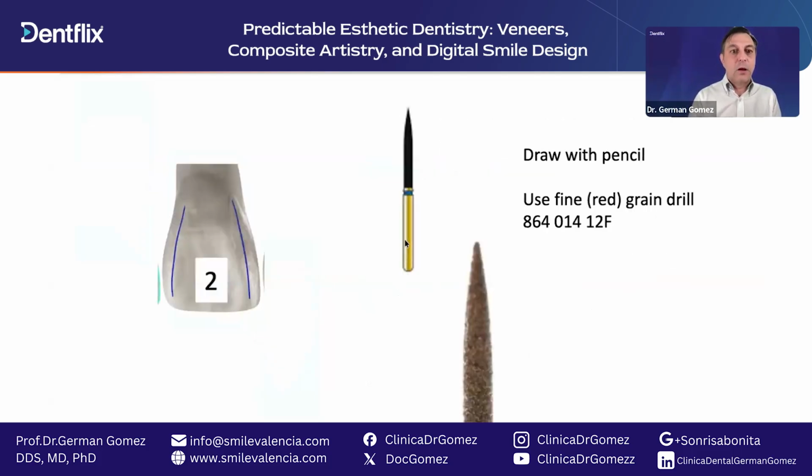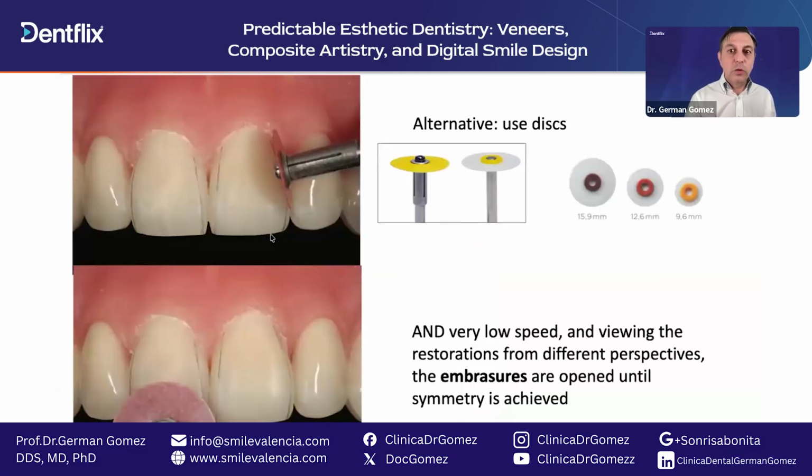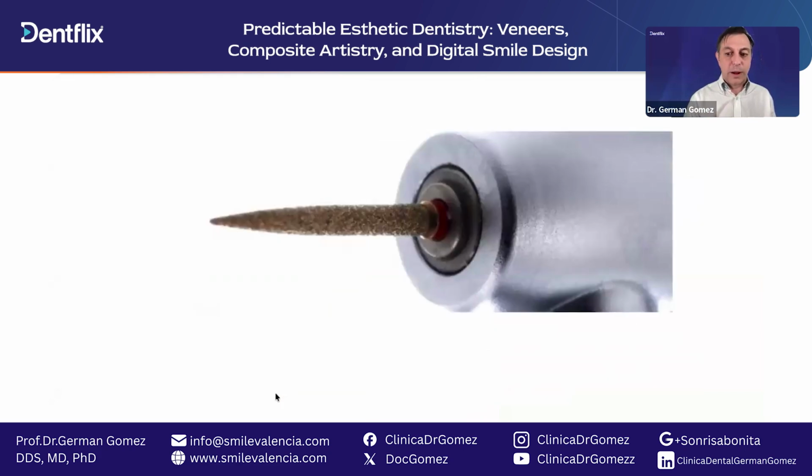How do we do that? We do these lines by drawing with a pencil. You draw with a pencil on the composite, and then you take away distal and mesial of these lines so that the lines stay there. Alternatively, you can use discs to do that. You just put these lines in pencil and then you just polish away. Good.